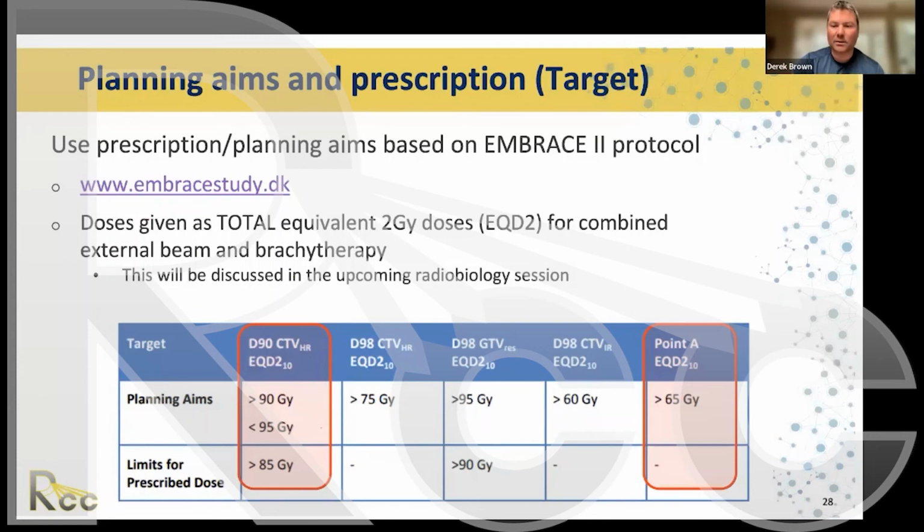If you digitize on one plane, then you're very likely to be missing what's going on, right? It's the same way for 2-dimensional. If all we have are 2-dimensional images, we still need 2 planes, right? We have one from the side and one from the top. Otherwise, we wouldn't be able to localize that applicator. It's the same idea. You really want to make use of all of your imaging planes when you're doing your digitization.